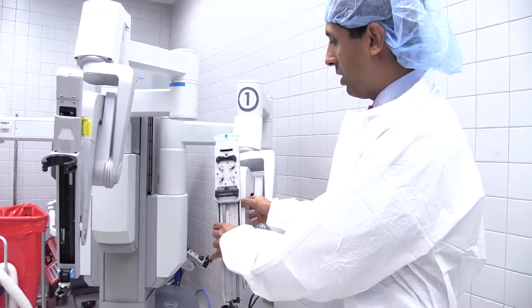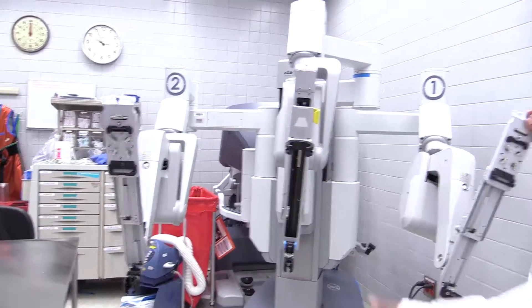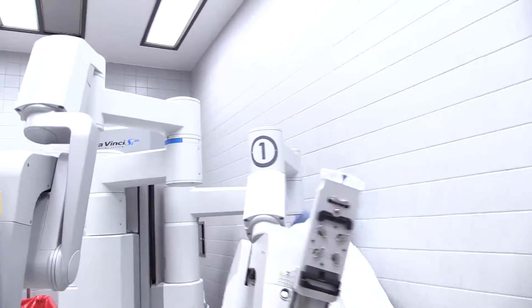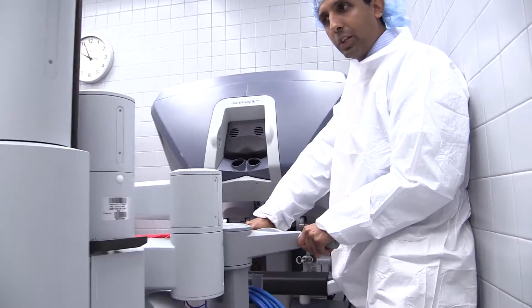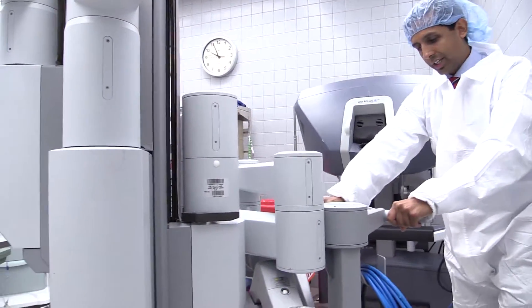My left hand will move this arm, and my right hand will move that arm, and then we have a camera right down the middle. This is a mobile unit, so we can move the machine right to the location we want to, right up to the patient — just like that.